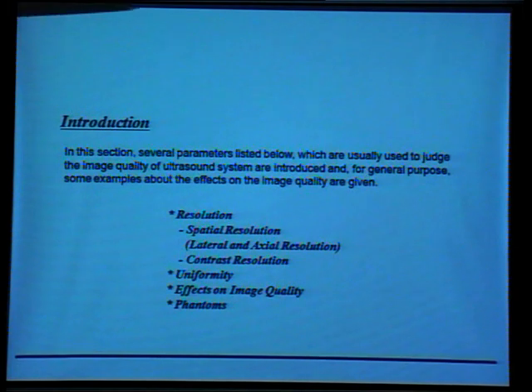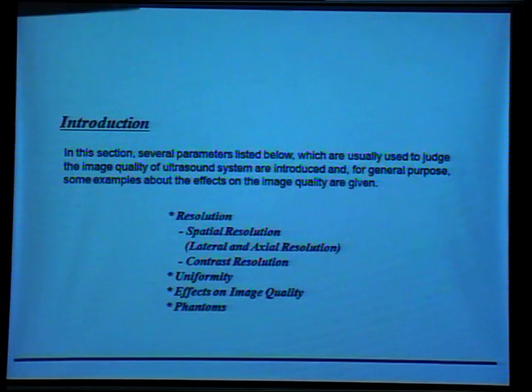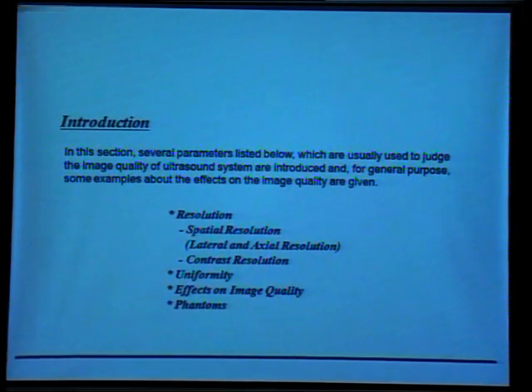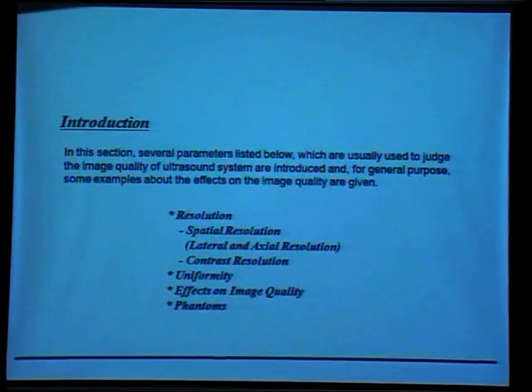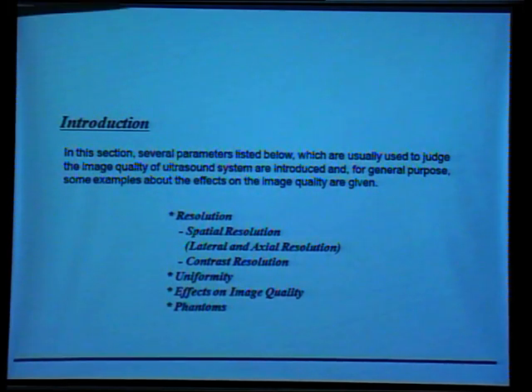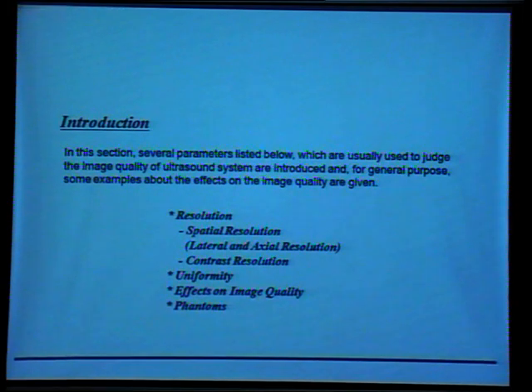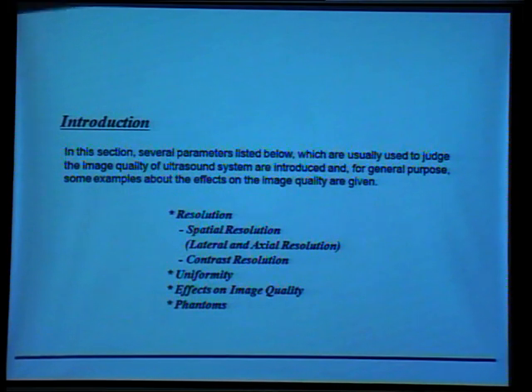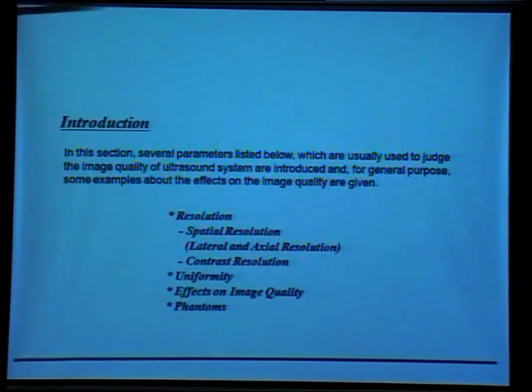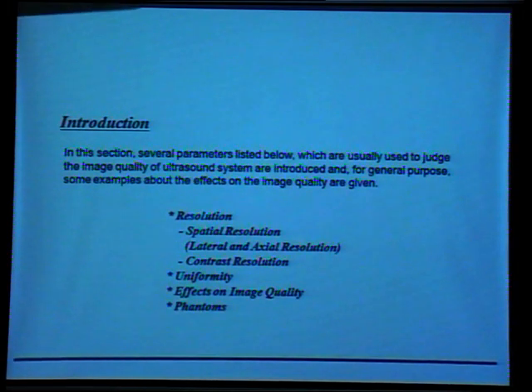Let me quickly take you through a little bit of when we do the image quality optimization. The most important word you will hear in radiology across, not only in ultrasound, it may be CT, MR, even CAT, people will say resolution. And resolution, what's the English meaning of resolution? Anyone can explain to me? If you have to explain resolution to your... can somebody explain resolution to me?